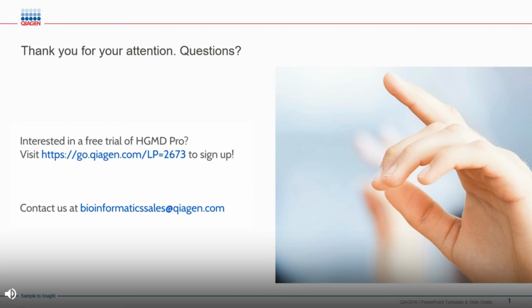Okay. Second question, is there an uploadable VCF with more information included from the HGMD entry? Yes. So with the download of genome tracks, which you can license, you have a number of different files that are specifically formatted for upload into UCSC. And there's different ways you can view the HGMD. You can view by phenotype and by disease mutation or functional polymorphism. So yes, that is definitely available.